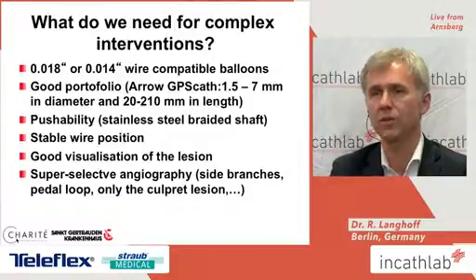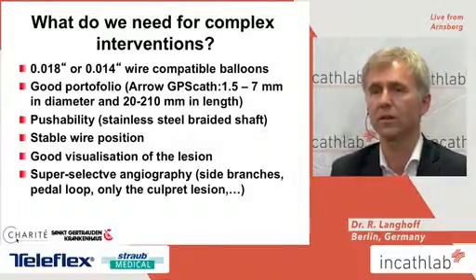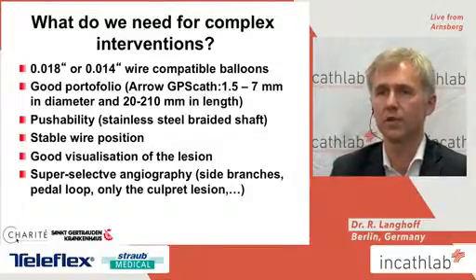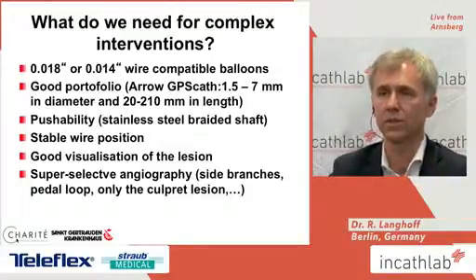Stable wire position is quite easy with this because you do not have to remove the wire to inject. You have a good visualization of the lesion, which is quite nice, and you are able to take super selective angle shots to see side branches, to see the pedal loop, and to define the culprit lesion which you wanted to treat.